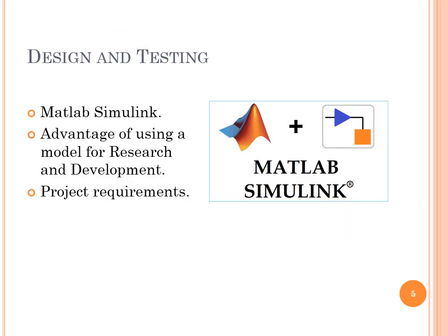Based on our previous research, we developed a model for the fluid pump using MATLAB Simulink. MATLAB Simulink provides an integrated development environment that uses building blocks instead of actual coding. The learning curve is relatively easy for engineers since it shares common mechanisms with other simulation software. And because it is developed by MATLAB, the user interface stays coherent and intuitive for the most part. The model is needed to reach an optimal design that can later be translated into a physical device with no need for trial and error, since all parameters and the best part are found using the model. This approach is a new trend in all engineering fields because of the easy and cheap startup of a project. Failures are detected and solved prior to the actual hardware development.